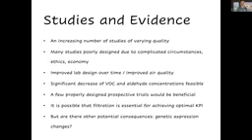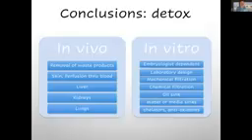But a few very good prospective trials will be beneficial for things like inline filters, or going from regular medical gases to nitrogen that comes from liquid nitrogen, so that you get an ultra-pure nitrogen gas in your system. Doing a prospective trial, to me, seems very doable. It's possible that filtration is essential for achieving optimal KPIs, but more proof is needed. There are other potential consequences that may be longer lasting, such as genetic expression changes, but that's just postulated; we have no proof of that.